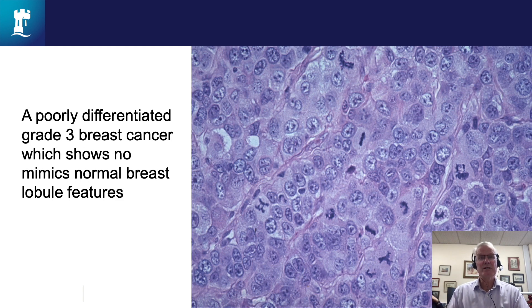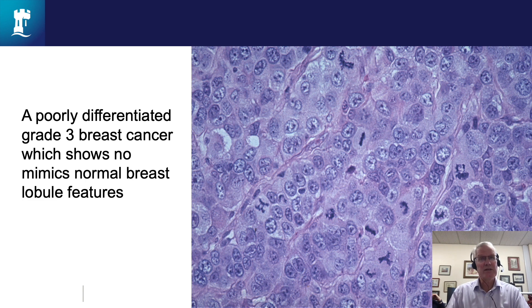In contrast, here we see a sheet of cancer cells — there's no evidence of gland formation and no resemblance to the normal lobule. Those dark figures, the sort of lettering-type figures, are mitotic figures — cells that are actively dividing in the tumour. This cancer is concentrating on growth, and behaviourally it's going to behave in a more aggressive fashion.